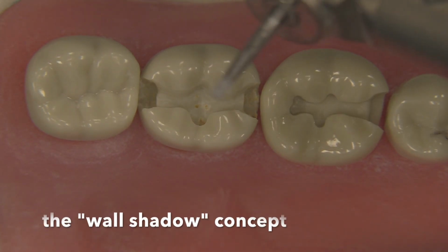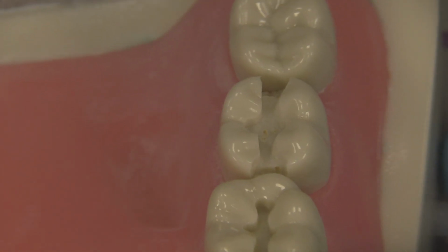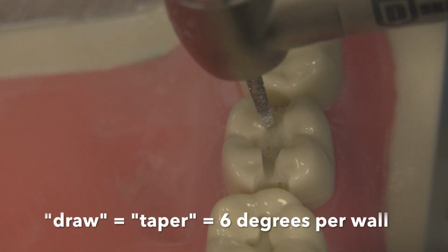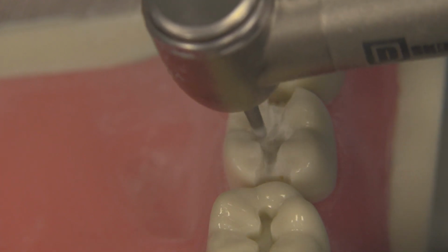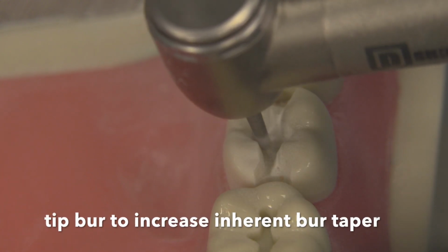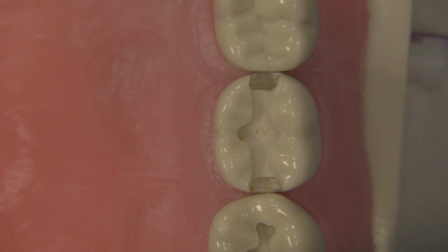And you see how we've got the wall shadow across that occlusal part? It's nice and uniform. So now you want to do the same thing on the lingual wall as you've done on the facial. You can look at it from the mesial view and get a pretty good idea of how much draw taper you need. Use your hand as a milling machine. Once again, keep going until you've got adequate taper.